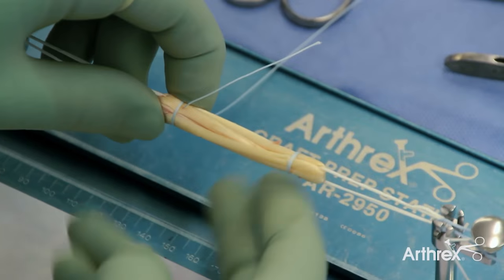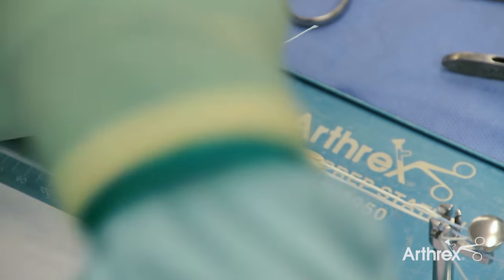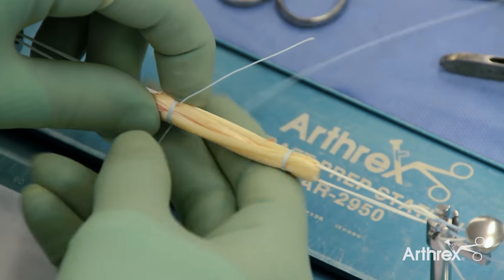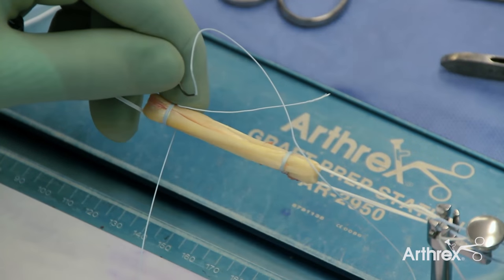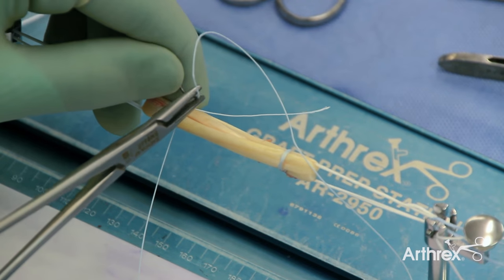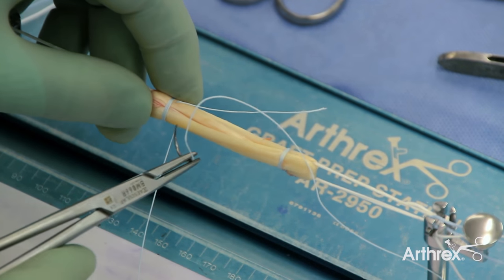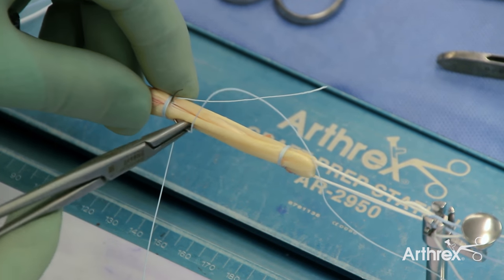Once more, I go around the graft three to four times, again keeping my index finger on the loops so they don't unravel. We cut the needle and bring it through centrally and finally tie.